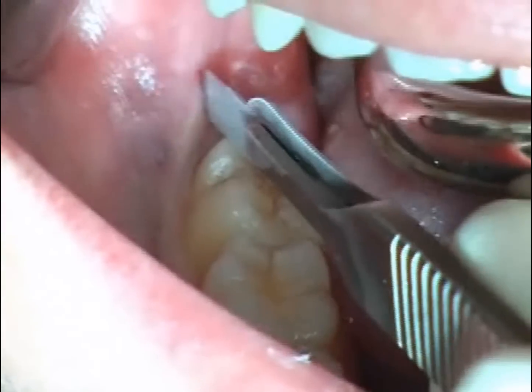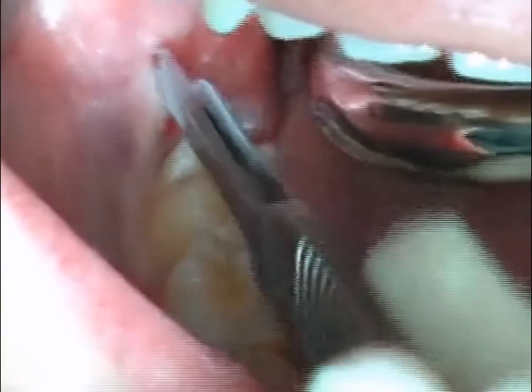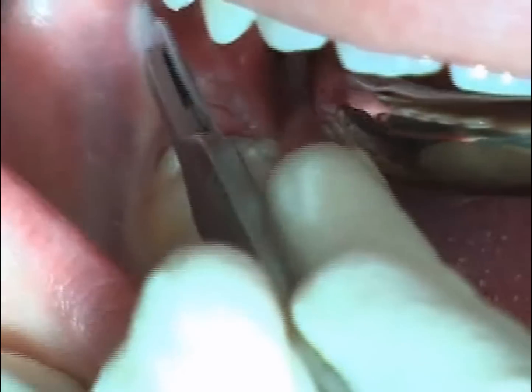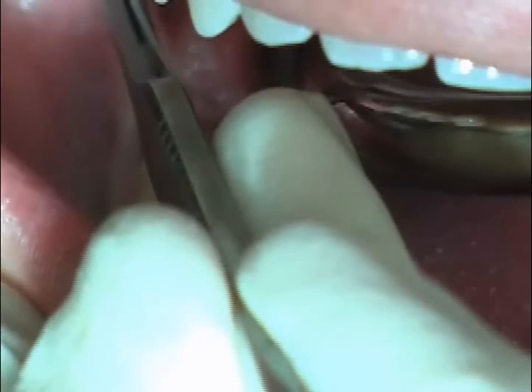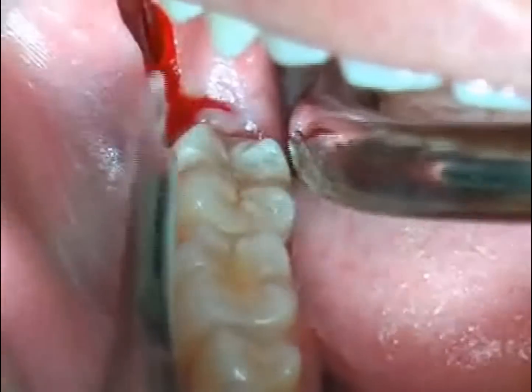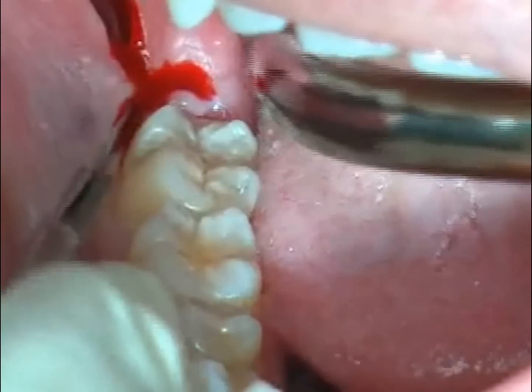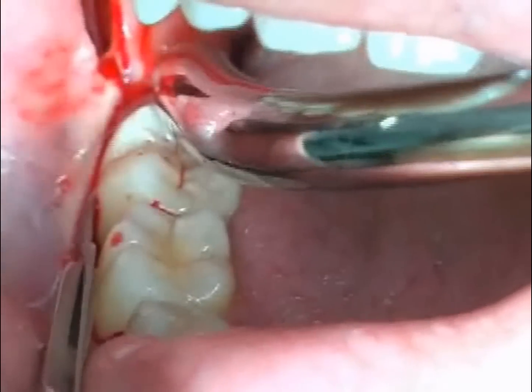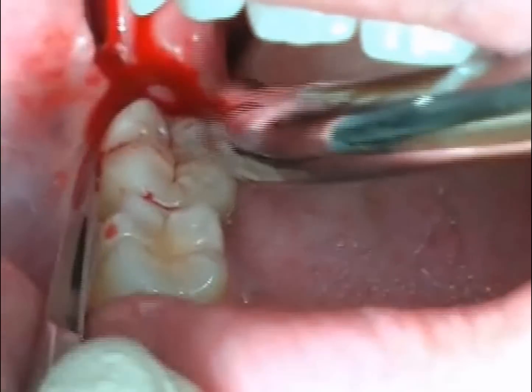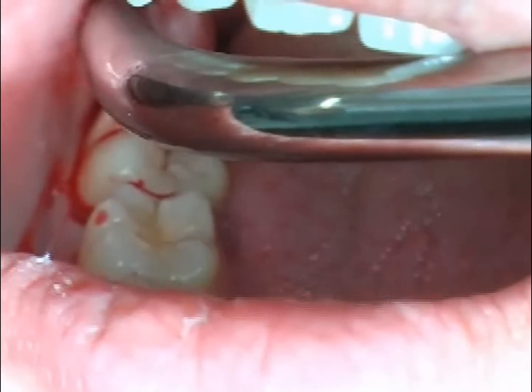First, the surgeon obtains an overview. He palpates the ascending branch of the lower jaw and properly places the Langenbeck. Then he makes the cut. A so-called gingival margin cut is made along the ascending branch of the lower jaw and on the number seven tooth.